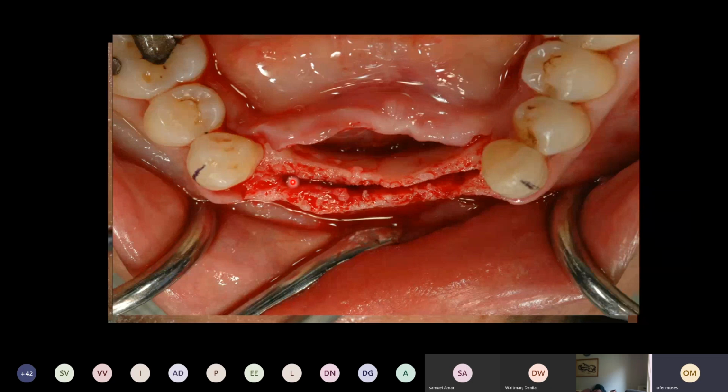You can notice here 1 hole, 2 holes, and 3 holes. We use this marking if we want to put an implant simultaneously with a split crest technique. This is because after the implant needs to be placed, this will guide the implant exactly into this area. Maybe till now it is not clear enough, but with time it will be more clear.